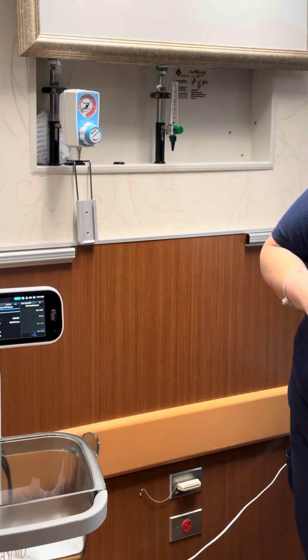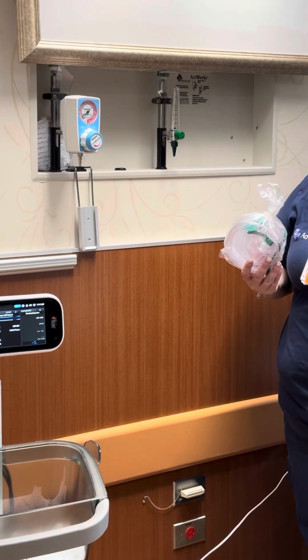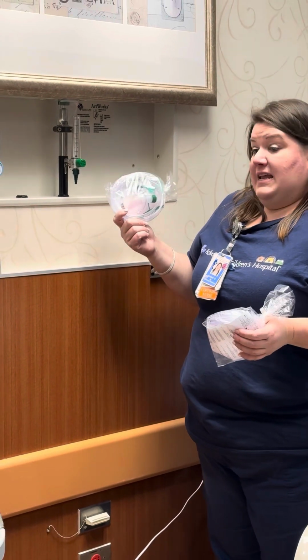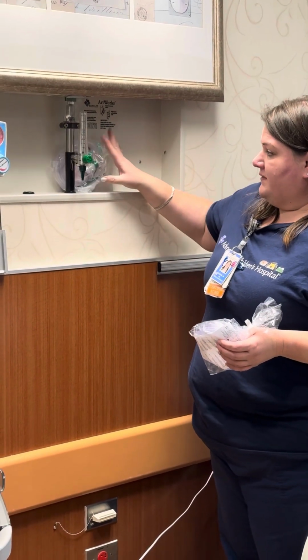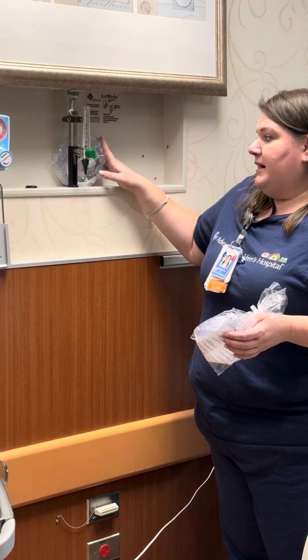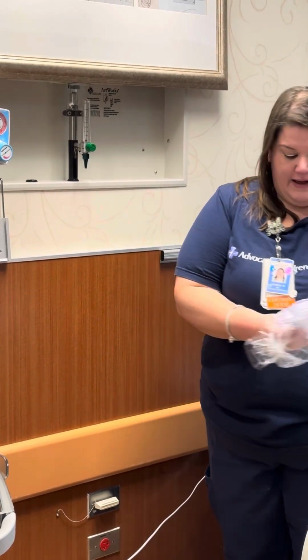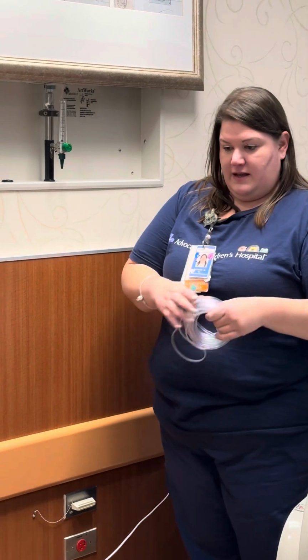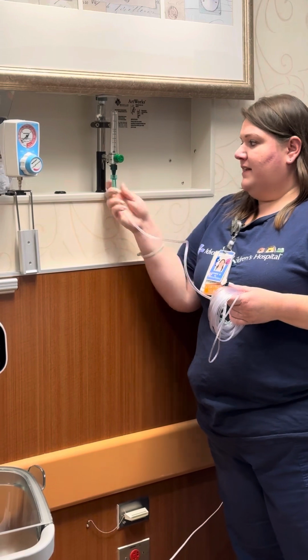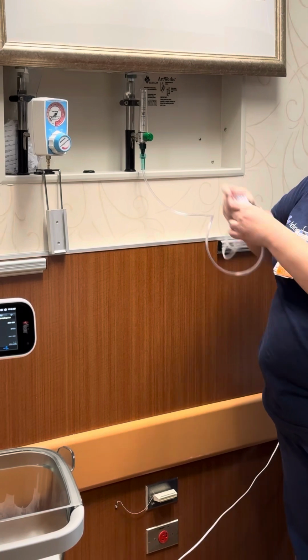Then once you're there, depending on whether you're going to possibly need it or if it's just for an emergency, you have your non-rebreather and you have your nasal cannula. If you're not needing it at the moment, it is okay to leave the package sitting here so you're ready to go in case of emergency. But if you need to open it and hook it up, you would just go ahead and unpackage it. And on the oxygen, there's the little tree on the bottom that goes into this tree. So work it on there and then just turn it up to whatever volume you would need. So that's your oxygen setup.